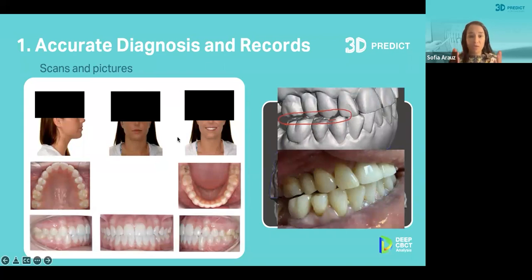It's a point of comparison because sometimes, as you can see here, the bites don't match in the scans and the pictures. And this happens quite often. And then it comes into the question of what actually is the patient's bite. In this case, you can see it's a very tiny difference, but the difference is there. Is the bite open in the canine or is it not? This makes a huge difference if we're gonna be closing that bite. And then we need to go back to the doctor and ask, which one is the bite?